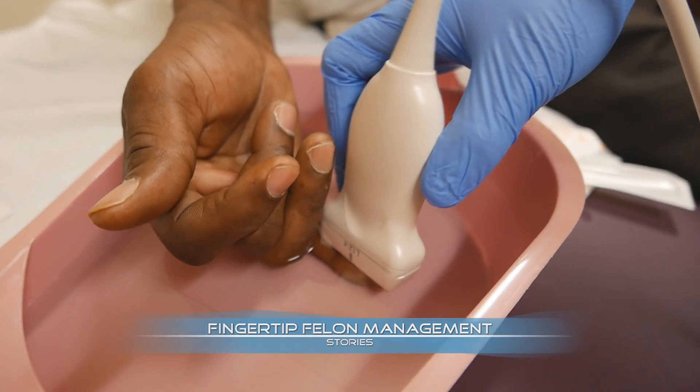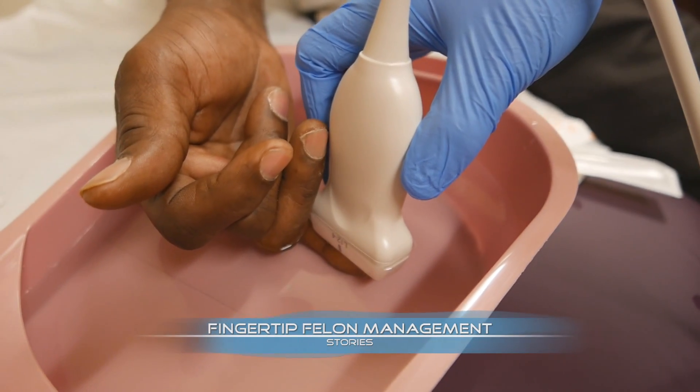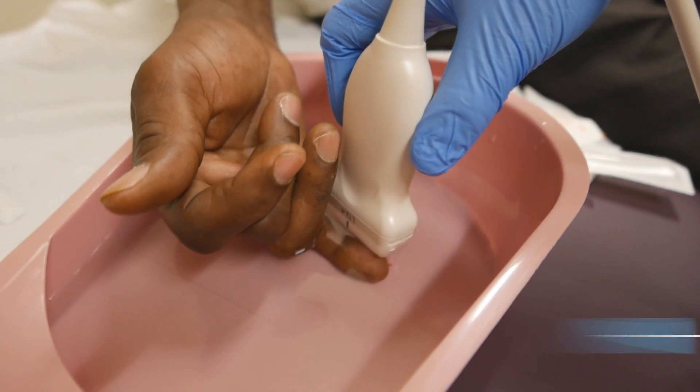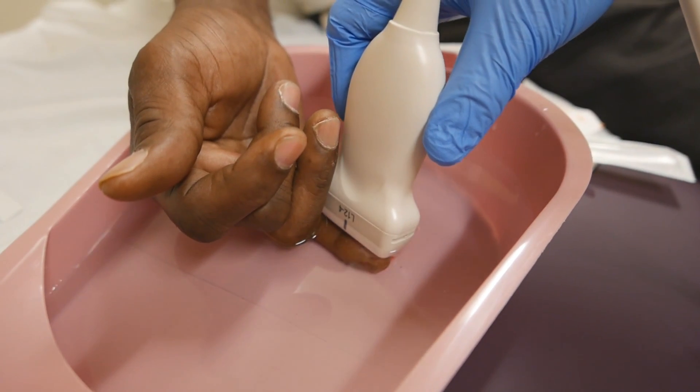So we're doing this in the water bath — you don't have to be right on top of it, just take it up and away. Near-field acoustic distortion is why we're doing this in the water bath, and I want to try and capture that.